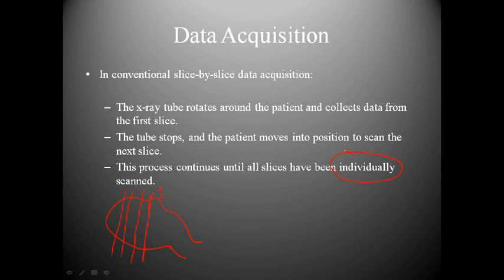Now, the problem with conventional slice-by-slice data acquisition is this. Time. It really doesn't cross your mind until you actually get a patient that will not cooperate.